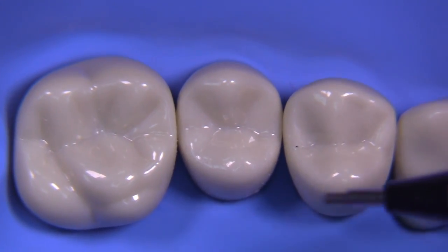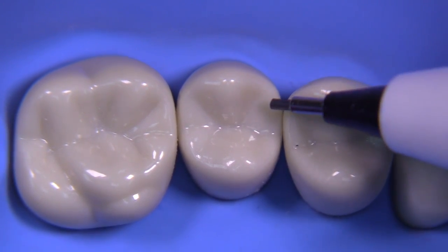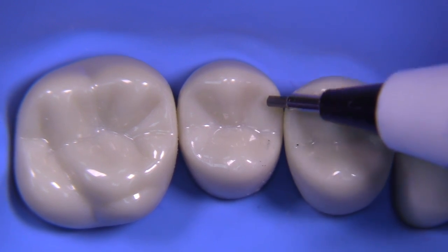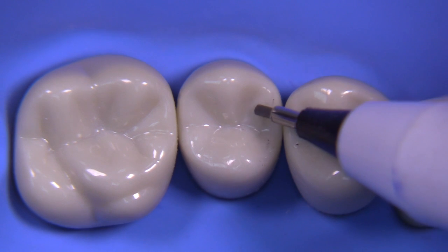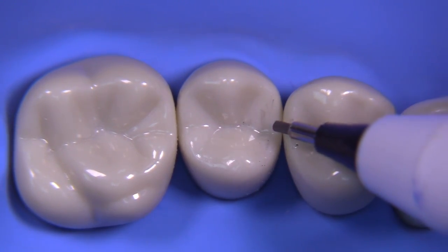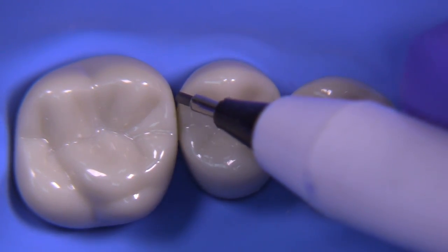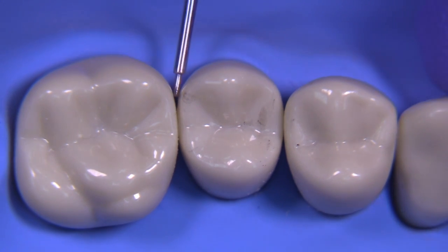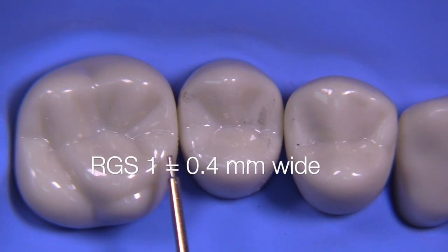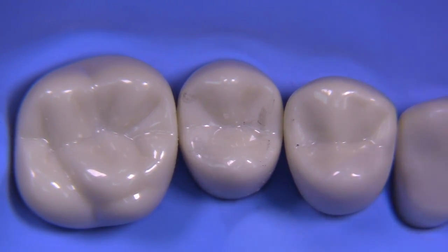The prep today is going to be on Columbia tooth number four, DO, and it's important to remember that the outline form has got to be done very precisely on this small tooth. One of the important features is the dovetail. We're going to want to make sure that the dovetail wall, that mesial wall, is located midway between the mesial pit and the height of the marginal ridge. Your extensions will be approximately 0.3 to 0.5 millimeters — this is the RGS1 which measures 0.4.